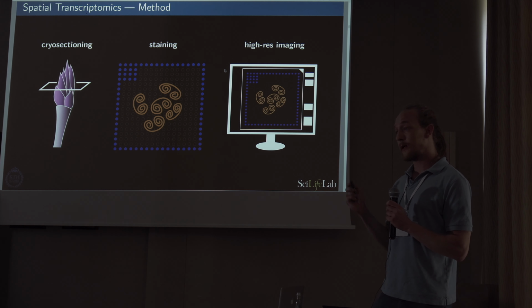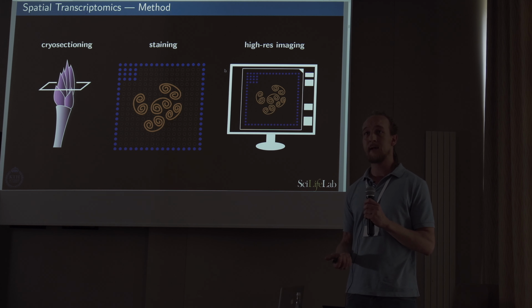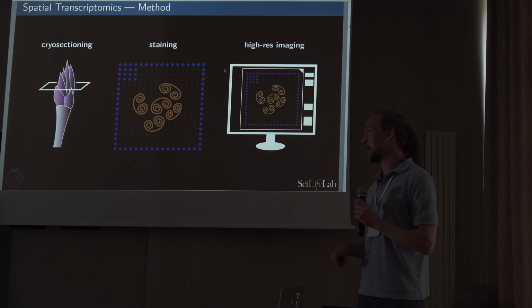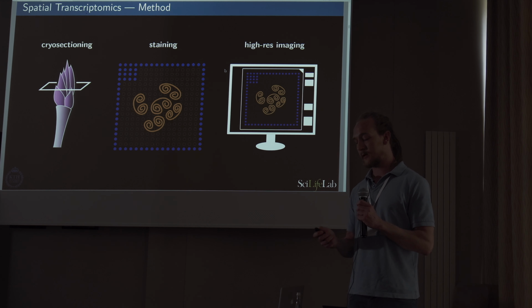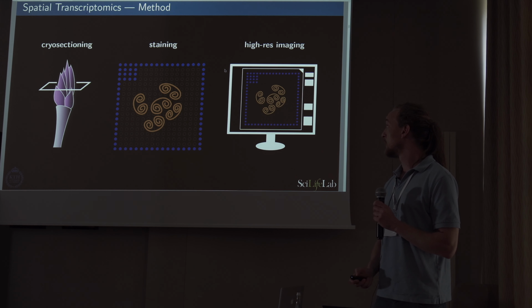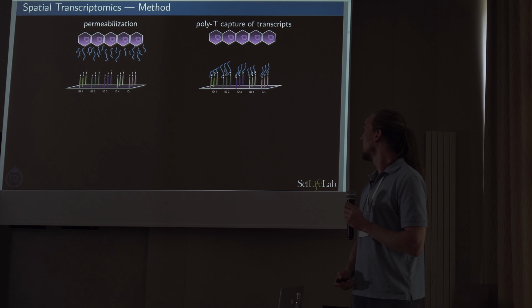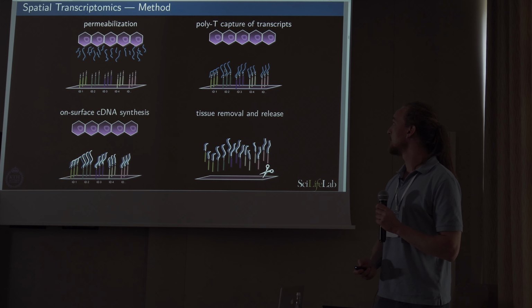The staining, as was remarked, is hematoxylin and eosin staining, the standard for pathology. And I'm not sure if perhaps fluorescent-based microscopy using antibody labeling might be interfering a little bit with the process. This is not really clear, but what we have now is definitely what has been used for decades in pathology. Yeah, I'll skip this. This was explained just now.